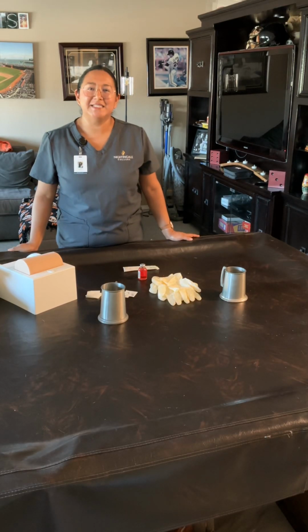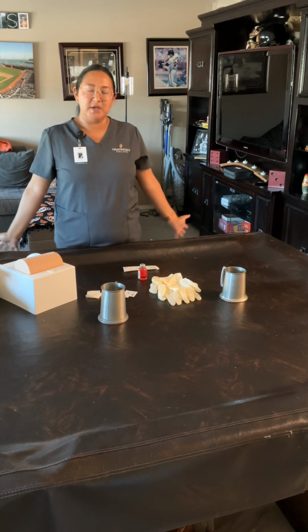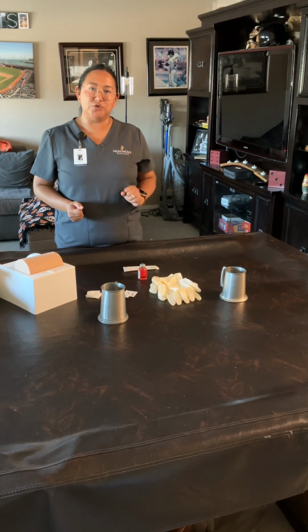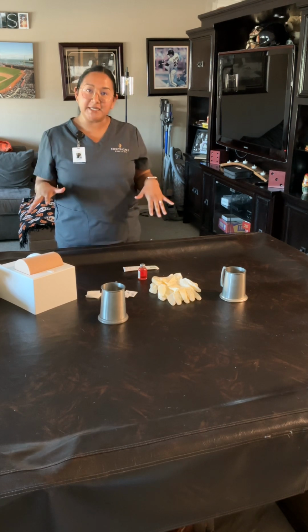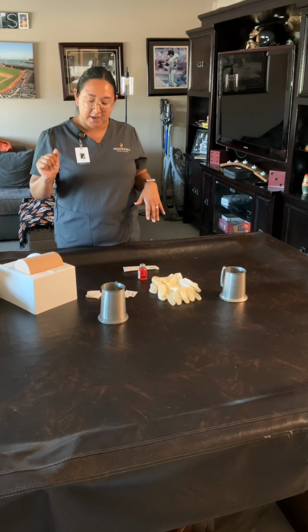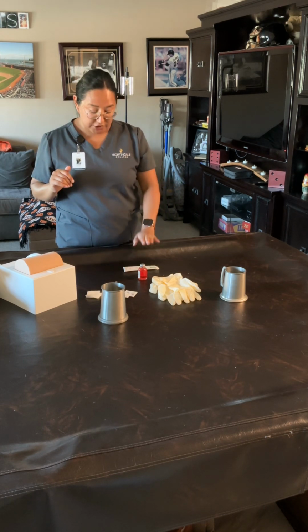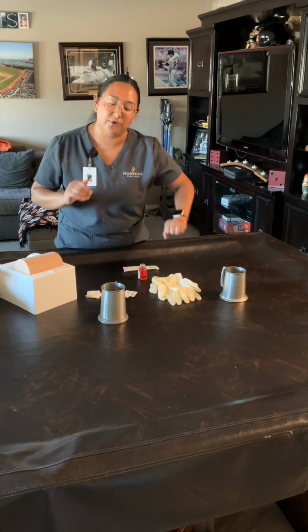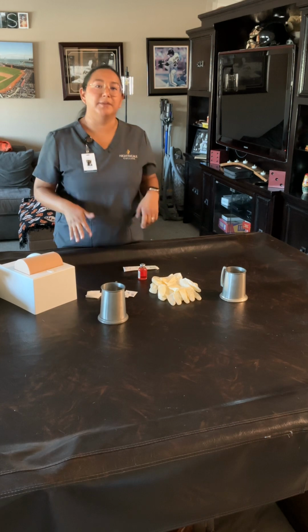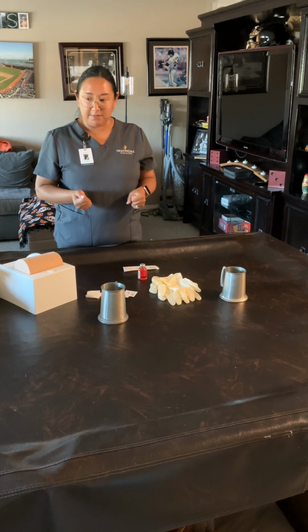My name is Amanda, and today I will be performing the administration of the subcutaneous injection skills video for BSN 225. I have gathered all my supplies. I have my patient, gauze, my alcohol prep pads, gloves, my medication, my syringe. This is my hand sanitizer for now, as well as my sharps container. I'm currently traveling, so I don't have all of my things, so I apologize.